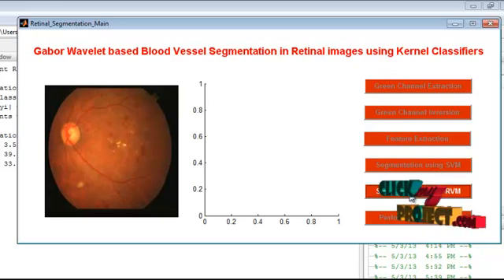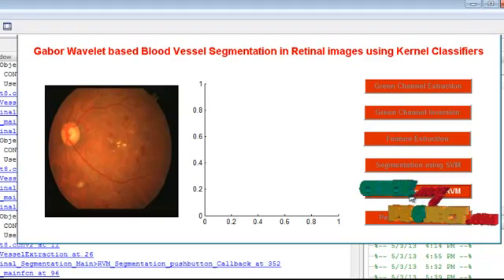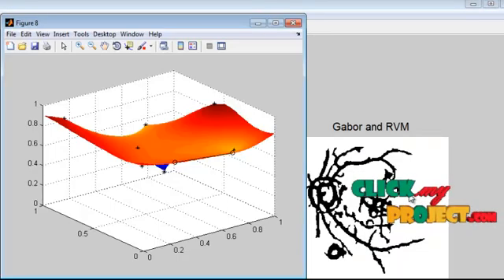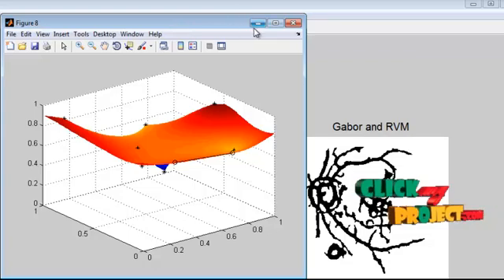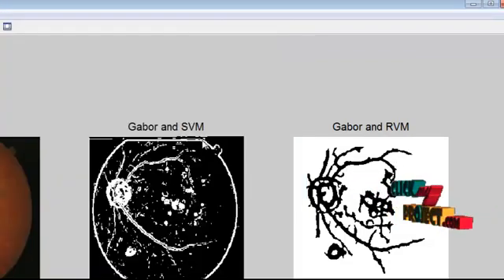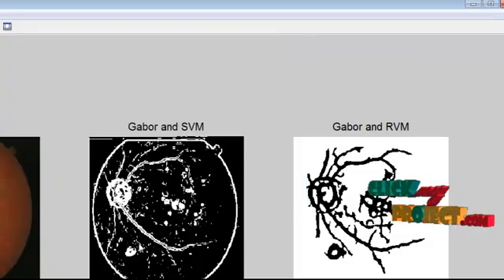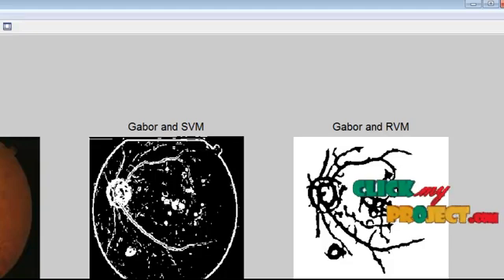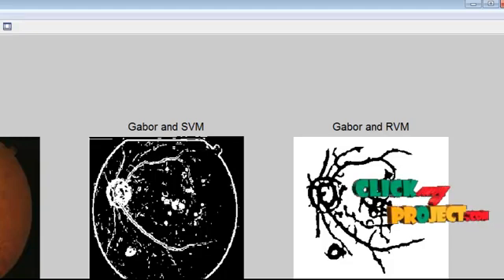Next is segmentation using RVM. Here we have obtained the RVM result alongside the SVM result and the original input image that was selected.